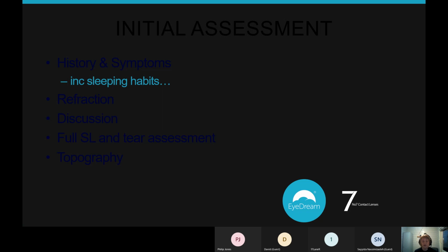because what we need when we do these calculations is we need to know that we've got the full prescription, and we need to know whether it matches with the corneal curvatures. So if we've got a patient with astigmatism, we want their cornea to have the same level of astigmatism, and so we need to know what the full prescription is.